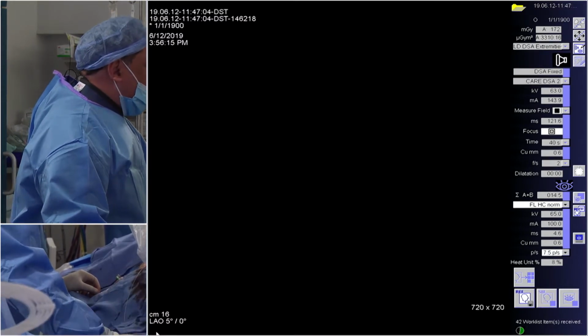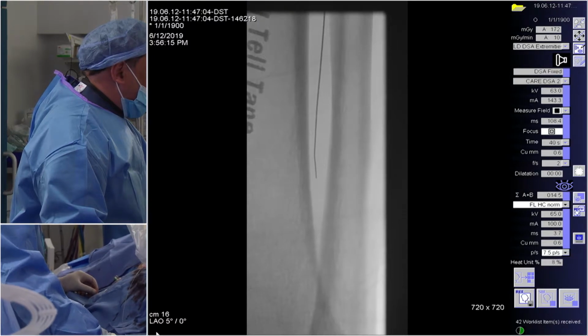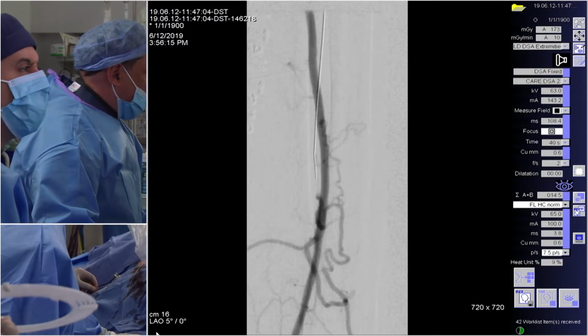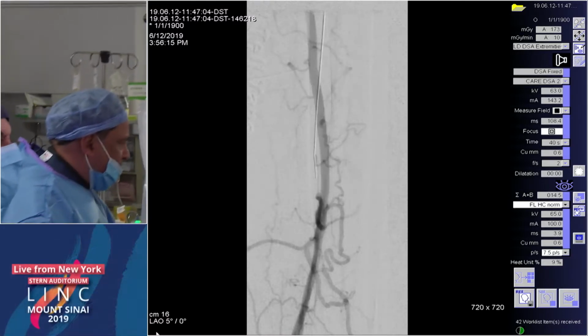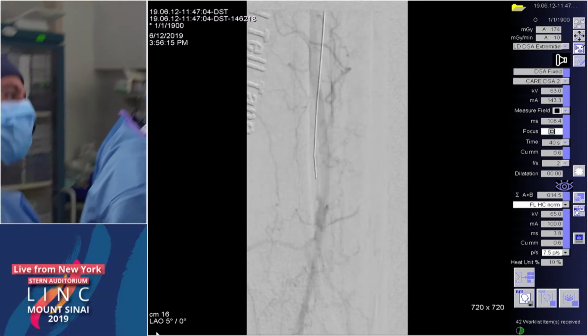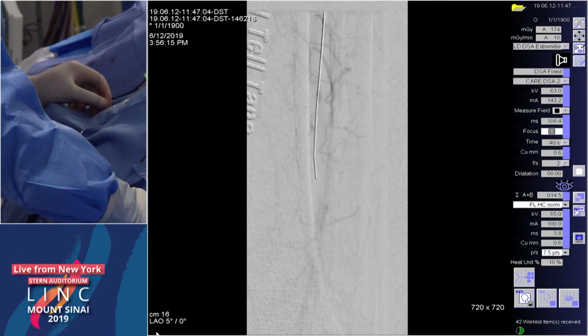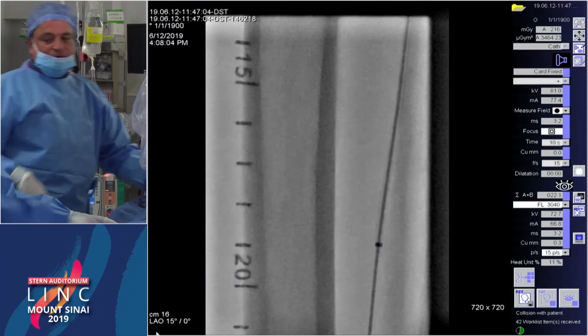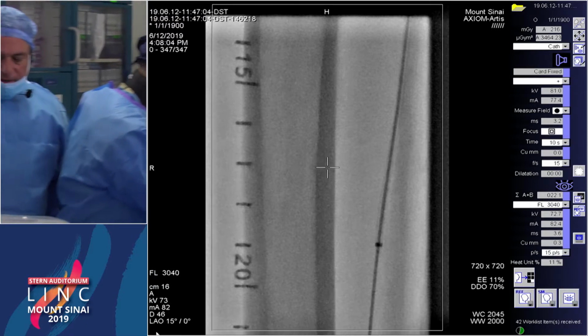So I think what's going to happen here is we're going to cross, and we're going to have to work with the PK. We're going to interrupt, and we're going to go back. We do have transmission from Leipzig, so we're going to go back quickly and see what Andre has come up with in his case. So Mike, what I did was, we'll show you as Vishal walks this out. You've got to do it off fluoro.